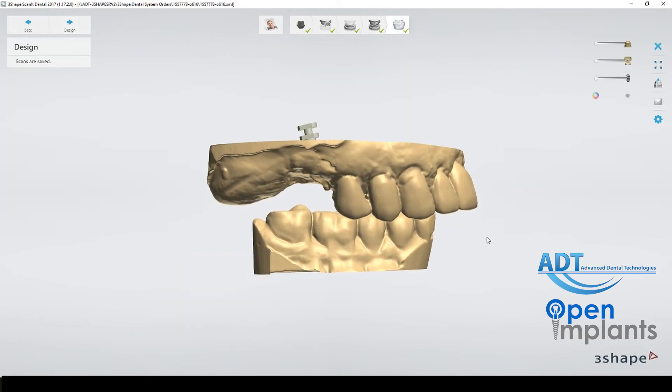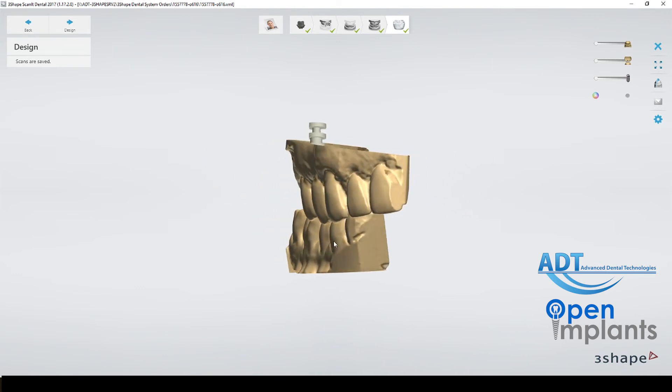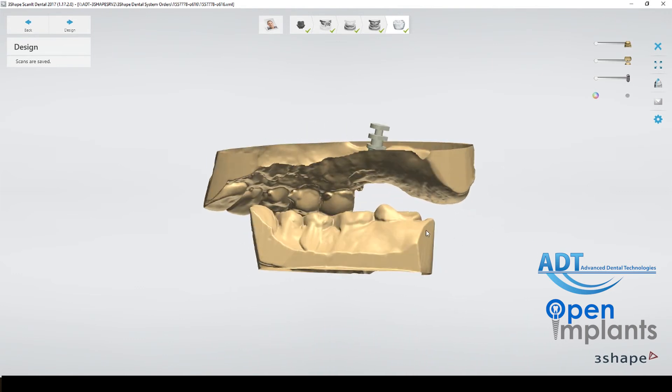And we are finished. This is how you scan an Open Implants case using the Open Implant scan bodies.